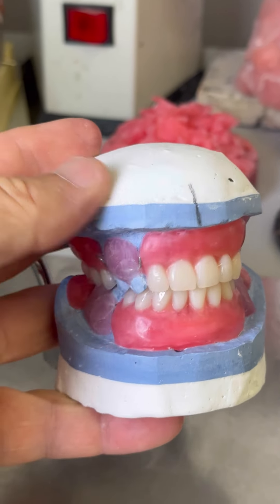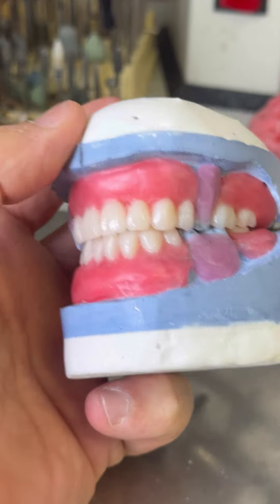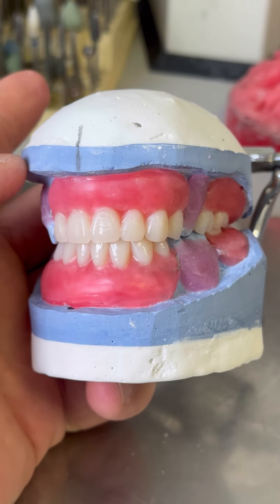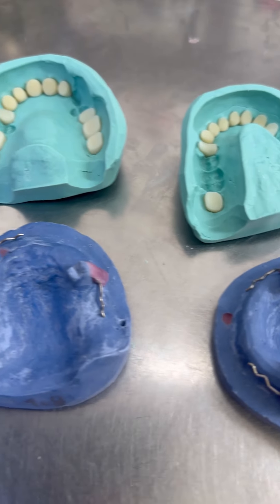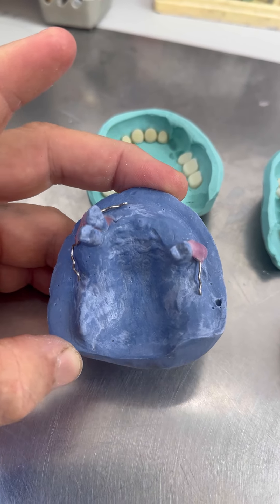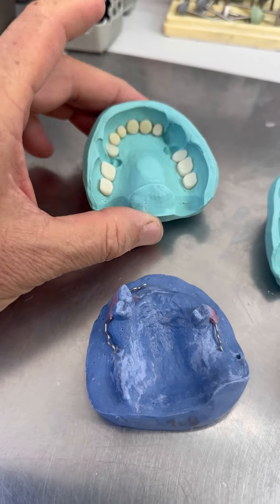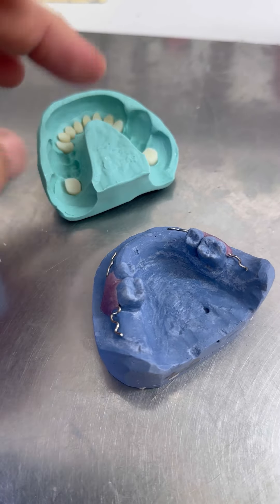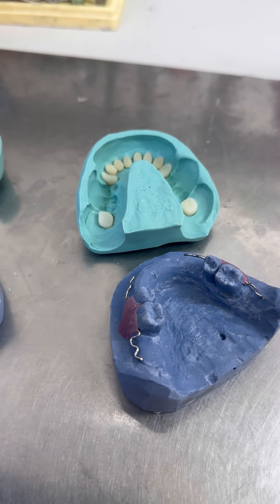Теперь будем его варить. Надо будет с артикулятора снять модель. Вот как у него зубки работают. Будем теперь варить зубы пациенту. Я ключ уже сделал на эти модели, изоляцией покрыл, крючки приклеил — которые на акриле. Тут уже зубы приклеил. Нижняя челюсть — та же самая. Теперь надо поставить ключ на место, на модель, и заливать и варить наши модели — временные верх и низ.